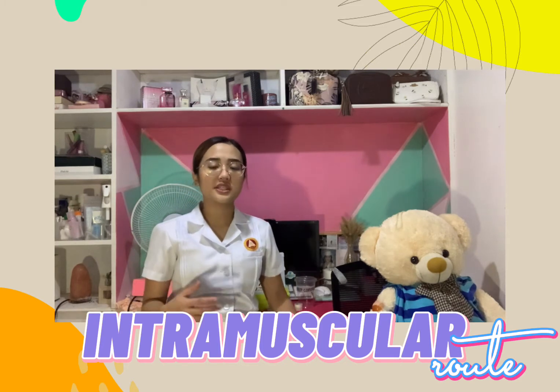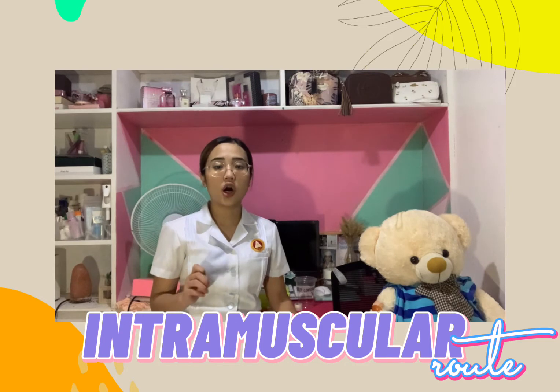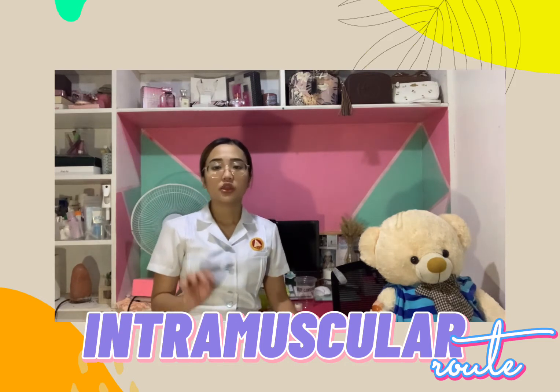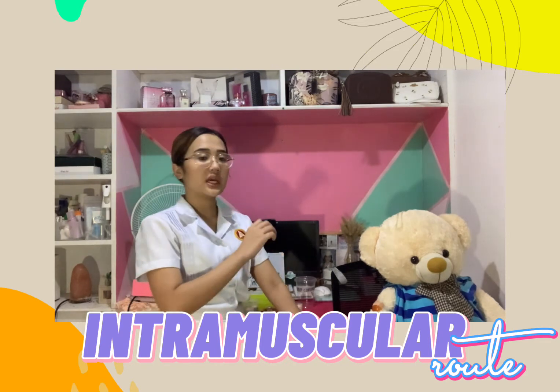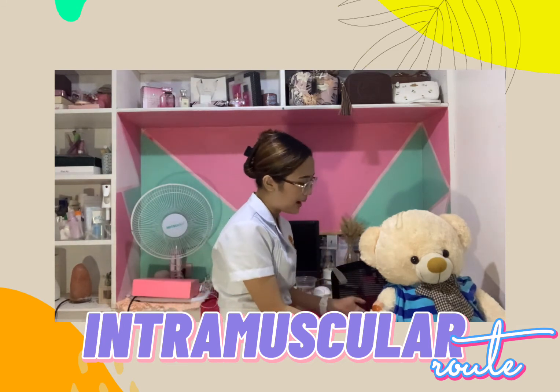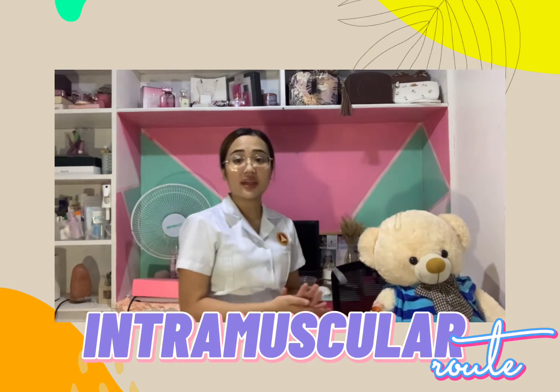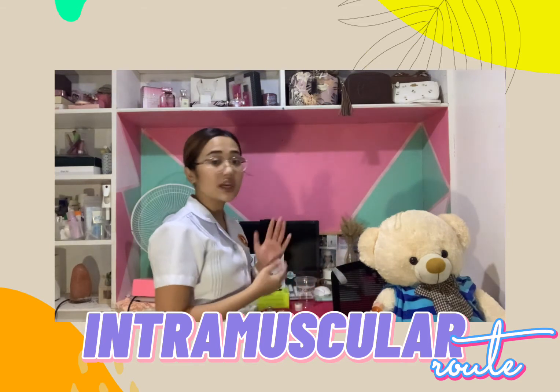And then we will position for the dorsogluteal, we will position our patient into a prone position, toes pointing inward. So, since we will administer the medication on the patient's deltoid area, our patient now is in sitting position, and ma'am, may I ask you po to relax your arm na po? Okay po. And then now we will start administering the medication to the patient.